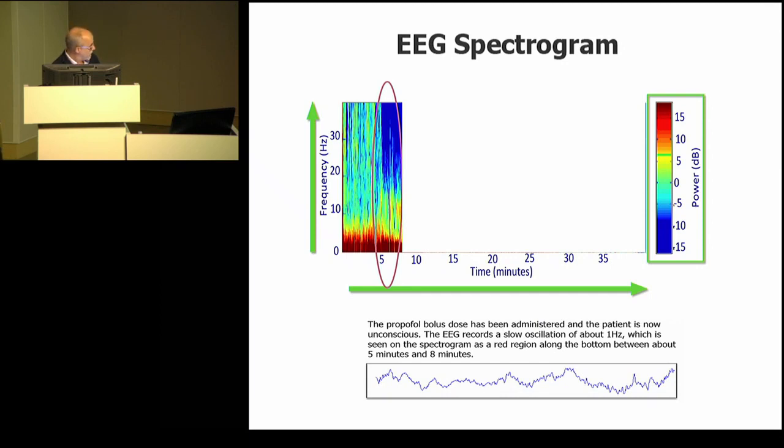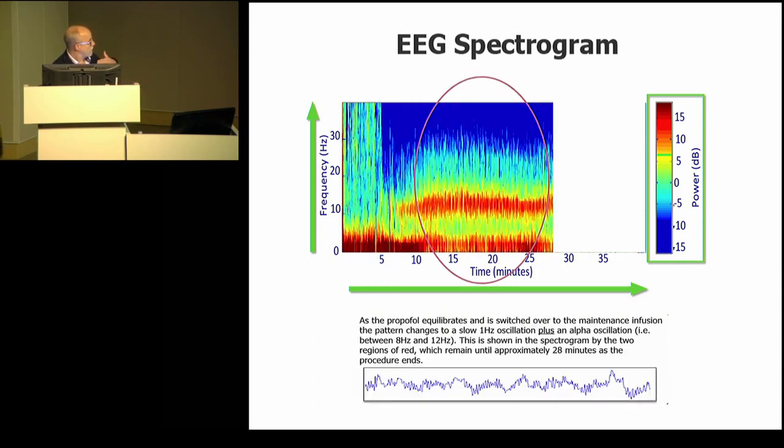You can see in the raw EEG these slow waves moving around. That will be dominant delta and its spectrogram. Just some time later, the alpha wave appears. And you see here the delta and the alpha, about 10 hertz. And you can see here, once again, the slow waves together with the alpha spindles here. Yeah, alpha spindles here. You can count them. 1, 2, 3, 4, 5.